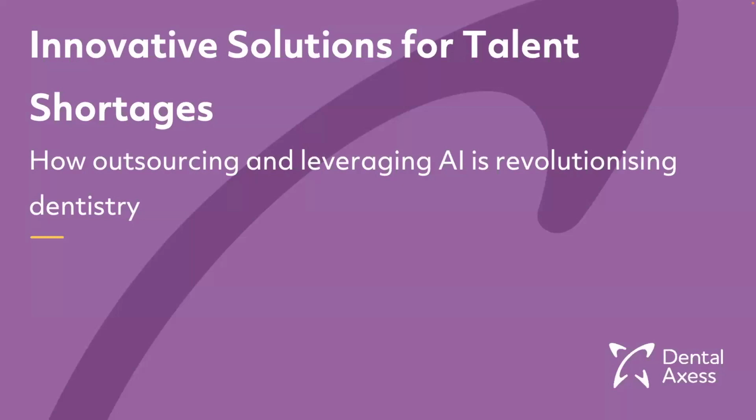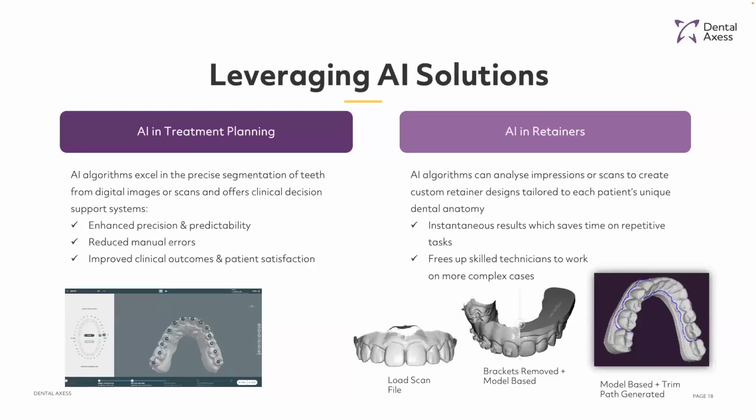Luckily for us, AI is rapidly emerging, and I am so excited to explore the impacts of AI technologies in different treatment planning and leveraging the power of AI to streamline retainer designs. Let's first discuss how AI enhances treatment planning in Dr. Tania's workflow.